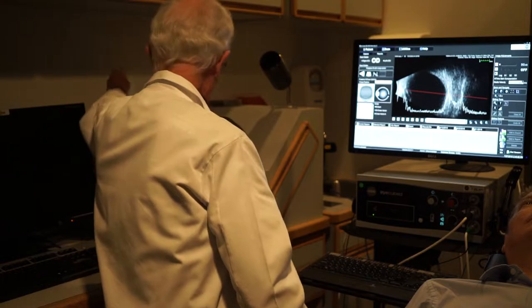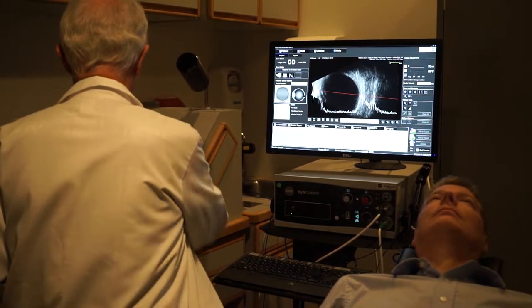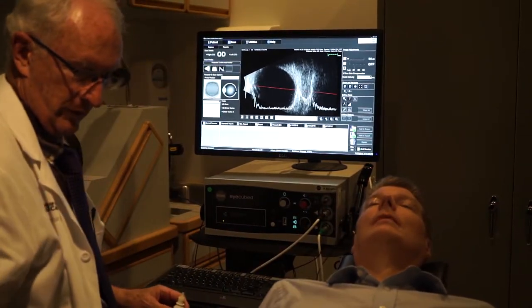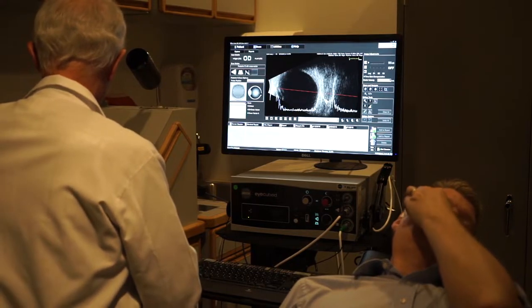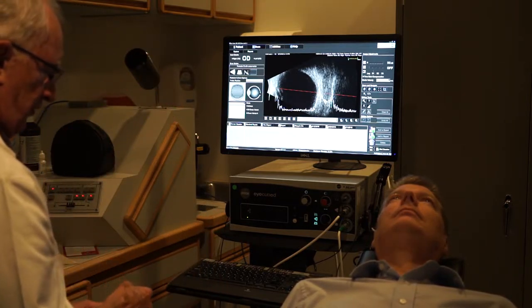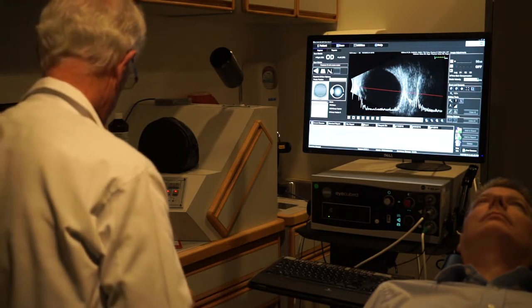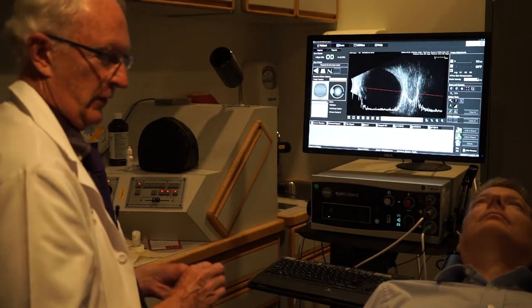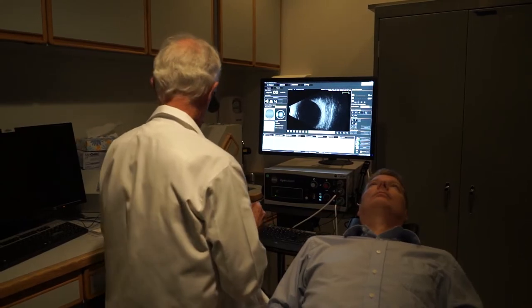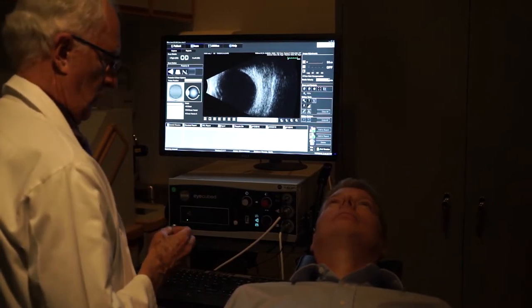I'll put another drop of anesthetic in our patient's eye to make it easier. There are different kinds of shells you can use with this, and there's also a bubble cover you can put over the tip — I'll show both. I use these shells a lot because I get a better view of the eye, but you can also use a bubble cover over the tip. We just put this little shell between the eyelids; the patient feels a bit of pressure. It usually doesn't hurt at all because we've anesthetized the eye, and I'll put some water in it.